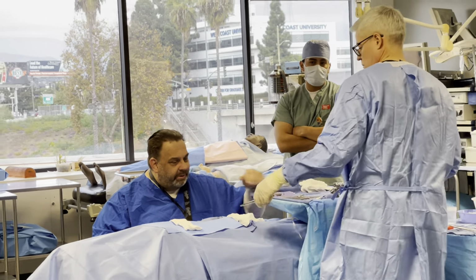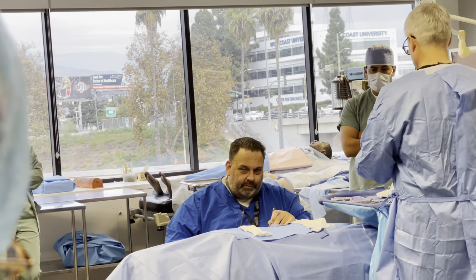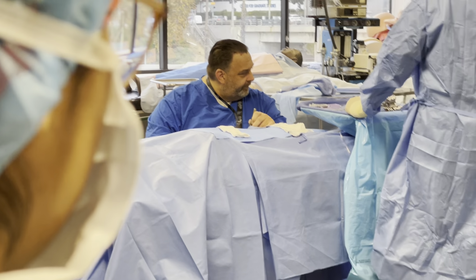We're doing a third and final count. What kind of count do we do now? What's the count called? Soft count. So once again, laps 1, 2, 3, 4, and one side. We're gonna count all the soft count stuff like we did before. And this is the point where you want to ask for your dressings. Nurse, can I get my dressings? Yep, just pop them on the back of my table, please.